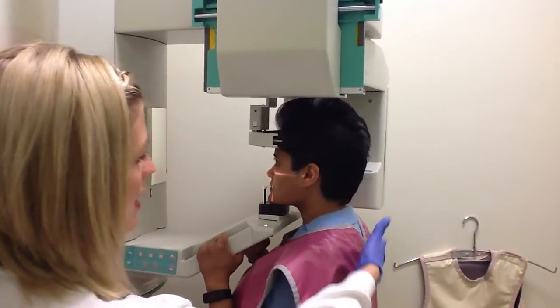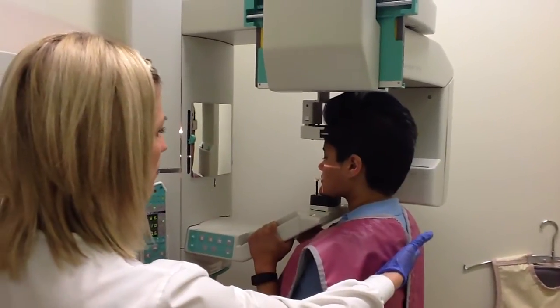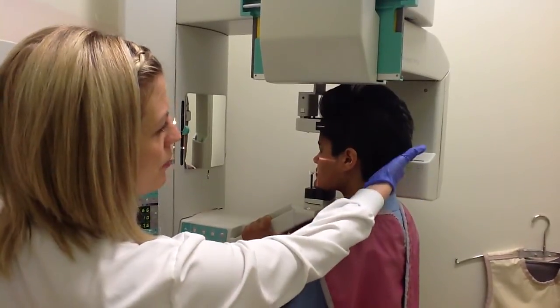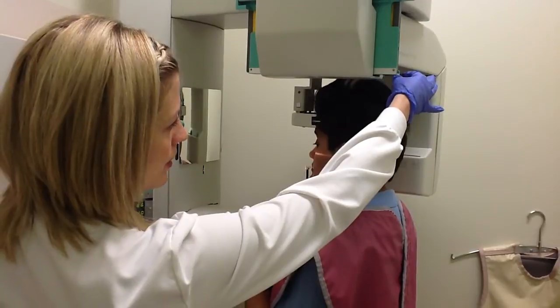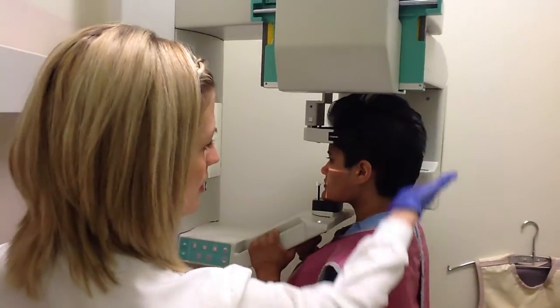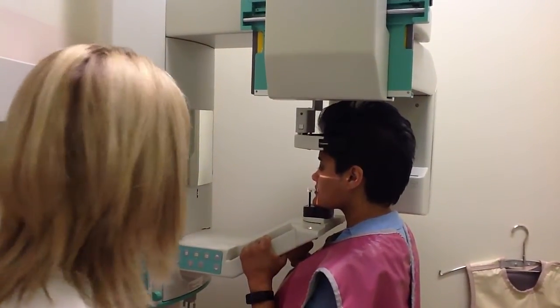At this point, I'm going to ask the patient to stand very tall. So you can stand as tall as possible. I really want you to stand straight. And I always support the back of the patient's head, giving them a little bit of pressure up so they know to stand tall. You can imagine a thread coming from the back of the patient's neck and pulling them up high here so we can elongate the torso and the spine.